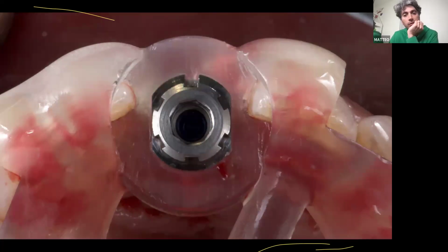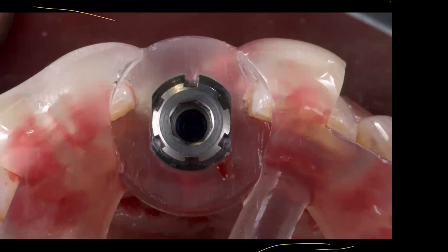As you can see, you could also position the polygon of the implant if you want to screw a restoration, to screw a previously prepared restoration. With this stabilizer we can set the facets of the implant's polygon, for example if you already made a temporary restoration from the implant level.